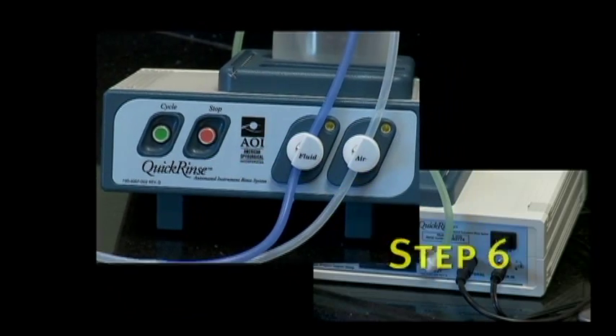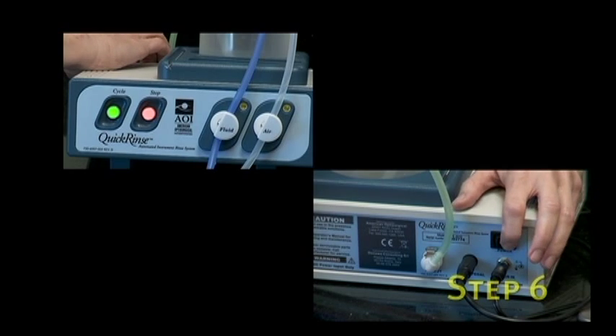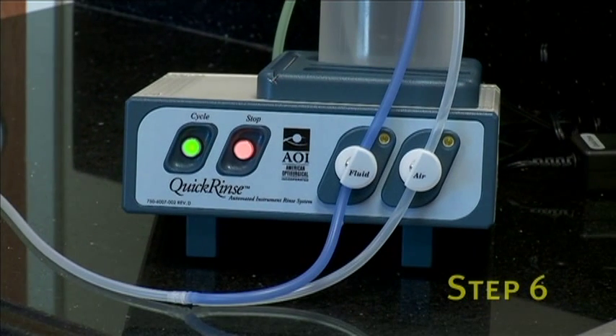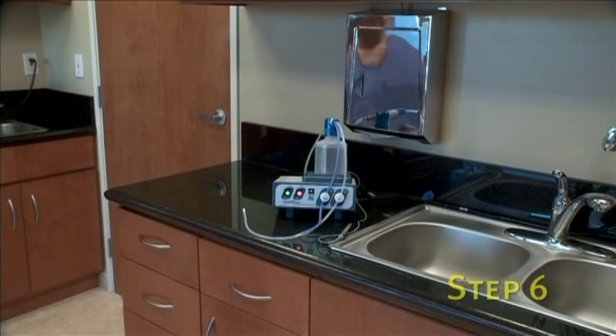The sixth and final step requires powering the unit. Press the power switch on the rear panel of the Quick Rinse to the on position in order to turn on the unit. This concludes the setup for your Quick Rinse automated instrument rinse system. It is now ready for operation.